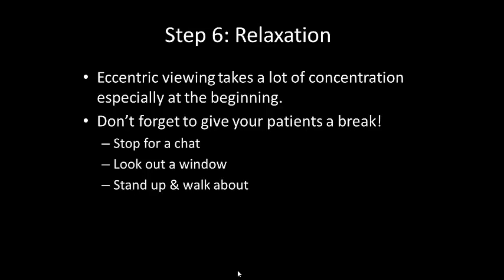Now, for those of you that are wondering, a typical eccentric viewing program, I find, takes about 45 minutes per session. Any longer than that, and I find that the patient just tires too much. And any shorter, and I just don't think you're offering enough training. So I'd say approximately 45 minutes. Sometimes if they're highly motivated and perhaps a bit of a younger patient, you can get away with a 60-minute training. So it is quite intensive.